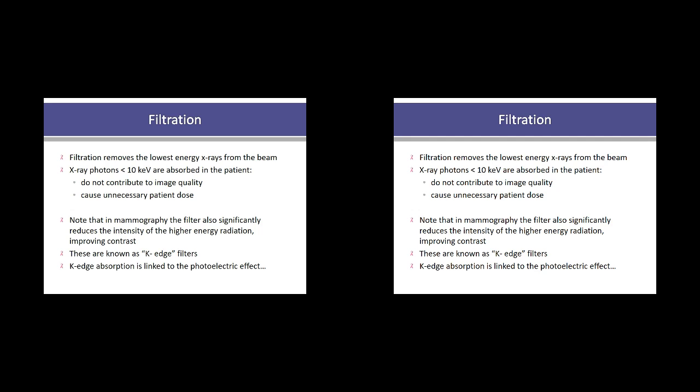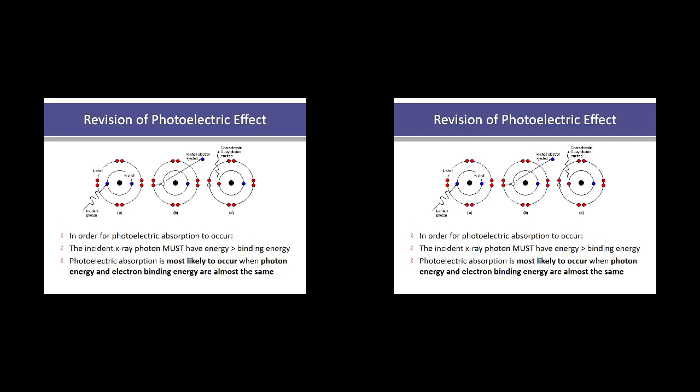And so the materials that we use are called K-edge filters, and this again comes back to the photoelectric effect. Sorry to keep going back to things that you've studied already, but as I say, it's hard. I find it hard even now after working in the field for so long. So I'm trying to build it up step by step so that hopefully it does make sense to you.